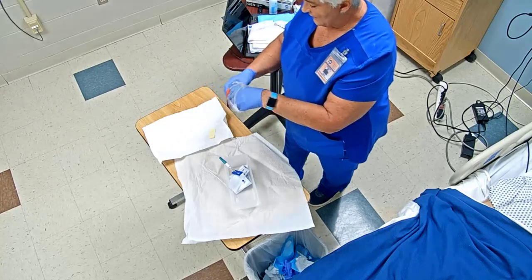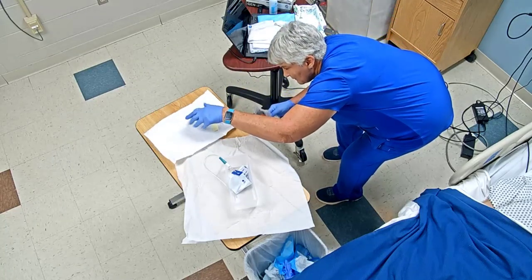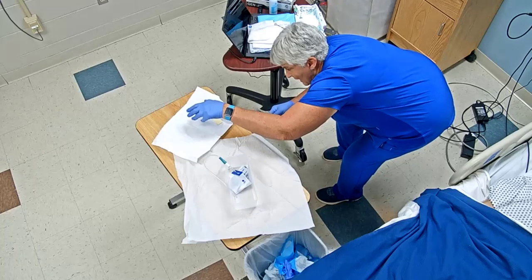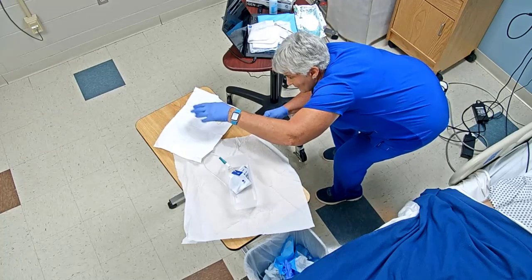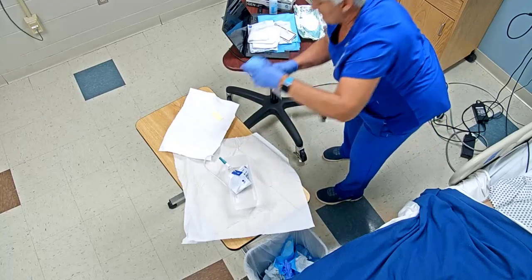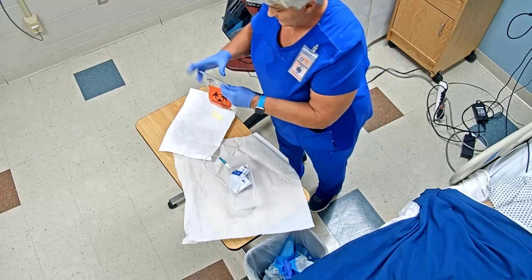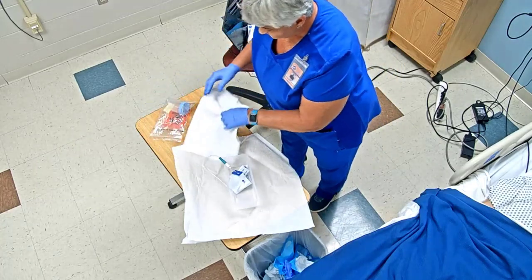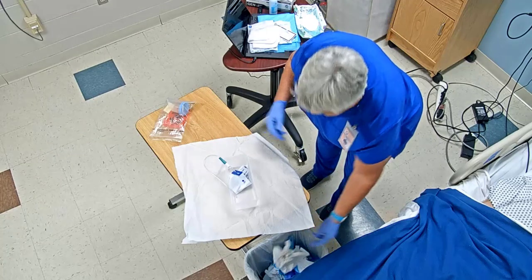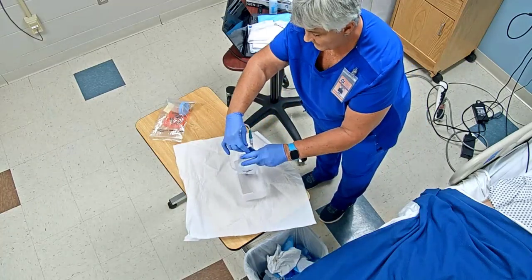Actually, before I do that, I'm going to go ahead and get eye level. Okay, and I do have 30 mils in there. Requisition will go in the side here. Now I'm going to take this and I'm going to go to the bathroom.